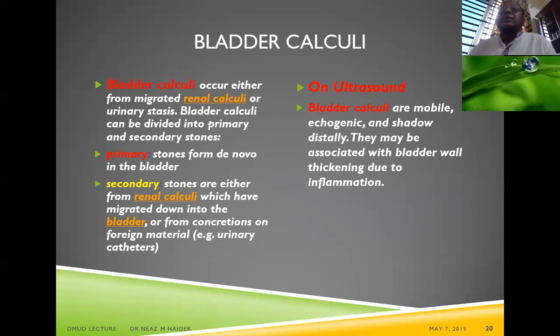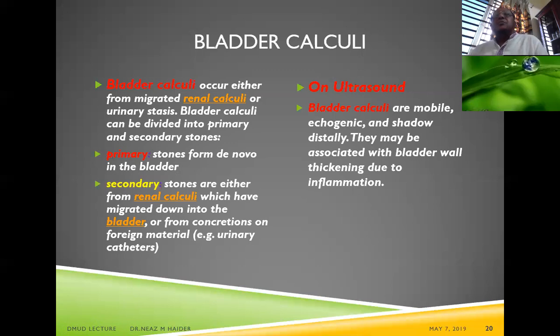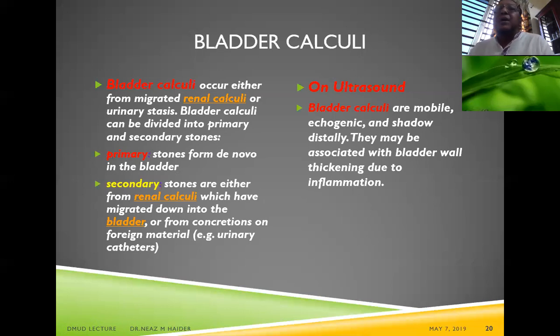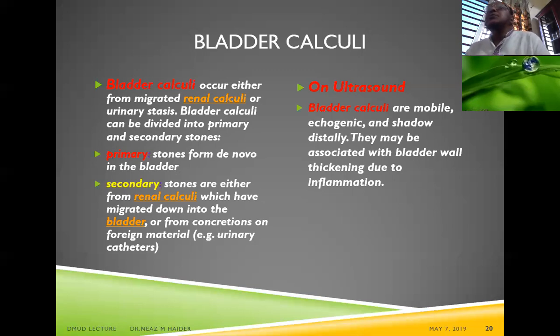Bladder calculi can occur from migrated renal calculi or form de novo. Primary stones form directly in the bladder; secondary stones either migrate from the kidneys or form as concretions on foreign materials such as urinary catheters. On ultrasound, bladder calculi are mobile, echogenic, and cast a posterior acoustic shadow. They may be associated with bladder wall thickening due to inflammation.